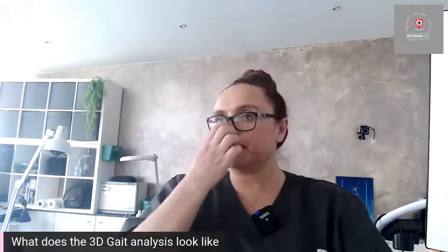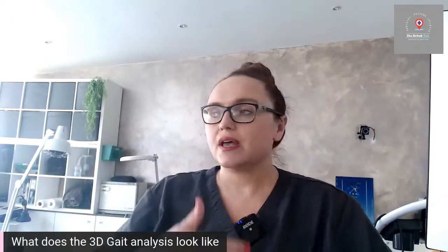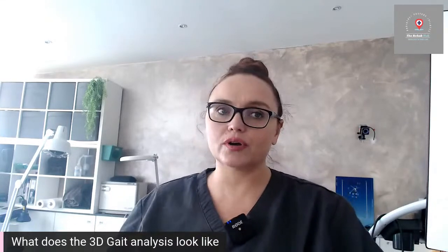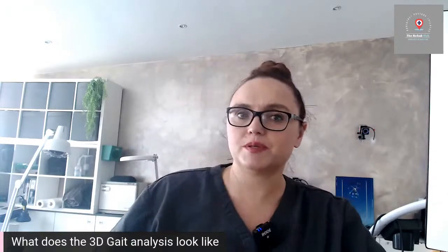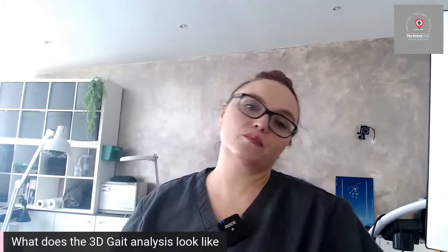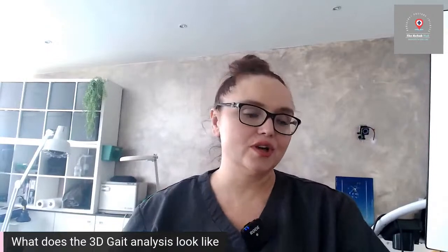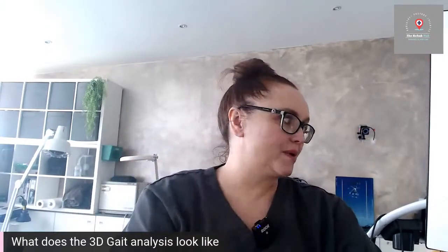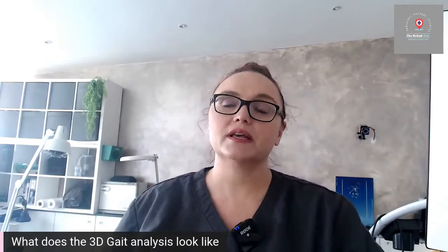If you're in pain, or if you've got an injury, or if you're running and you're getting niggles, basically anybody who walks, so you don't need to be a runner to do this. If you're maybe a hill walker as well, and you're getting wee tweaks, maybe it's your lower back, maybe it's your hips, maybe it's your knees, and you want some answers because you want to know, well, why is that happening? Then this is the most accurate assessment that you could get. When you come in and get this, the assessment takes about an hour and a half. It's a really thorough assessment.